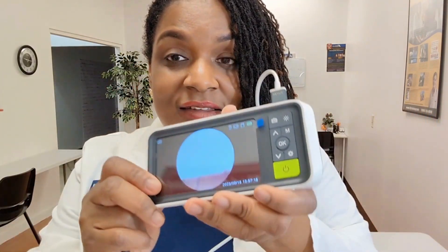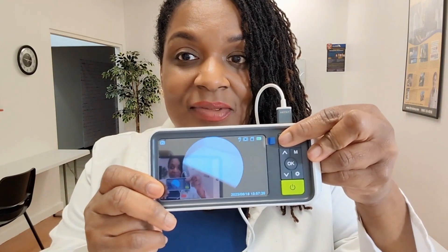You see the camera icon — we're just going to take a picture while it's still in the ear. It would save the picture. You can download it and share it for research, for education, in order to improve your students' assessment skills.